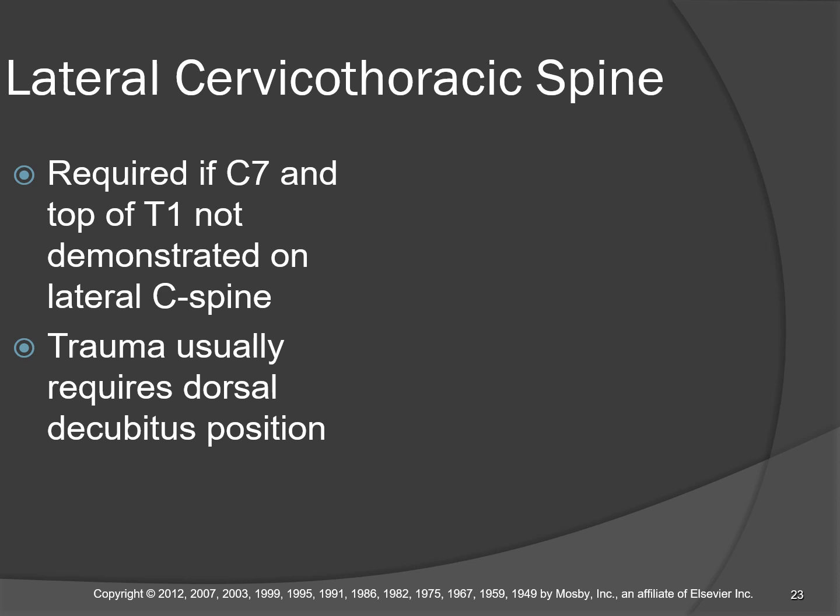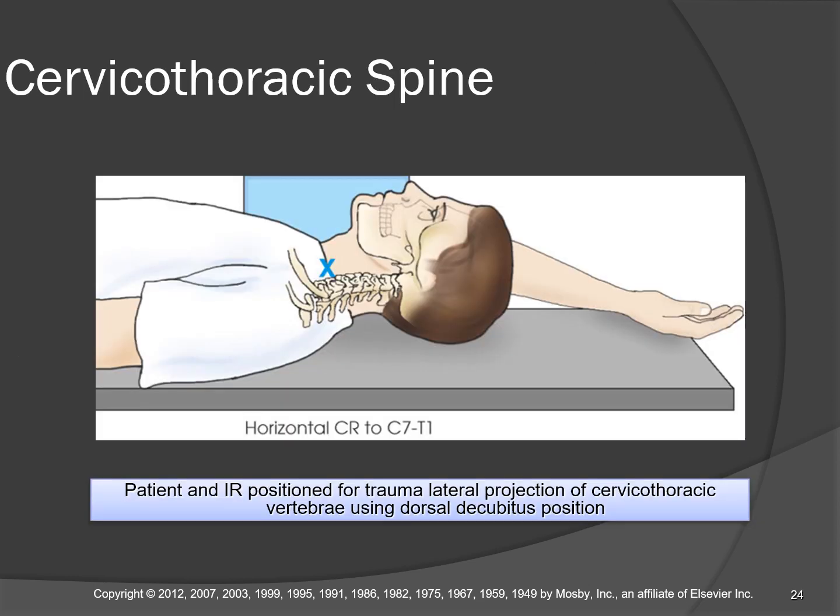And that'll help you separate the shoulders just a little bit more. Okay? So there we go. We're centering for C7T1. The one shoulder is elevated, the other shoulder is relaxed. Ask your patient if they can move their arms without pain before you place them in this position. You can also apply traction in opposite directions here to create more separation.